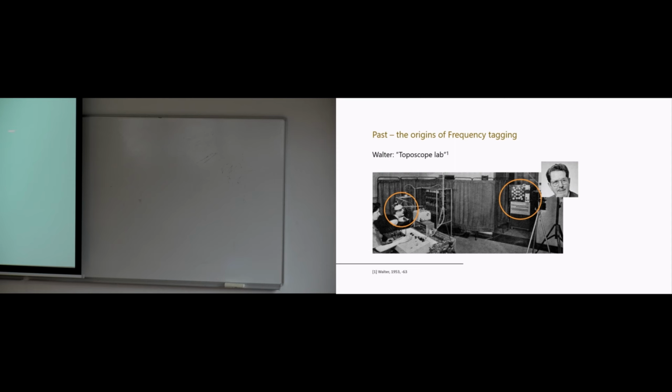And the most interesting part actually is this device back here. So they built this apparatus that allowed them to take the signal that they recorded, also from quite a high number of electrodes for the times back then, and look into the phase, the relative phase of the rhythms that they recorded from the scalp here, right? So I'm assuming that you're all relatively knowledgeable when it comes to oscillations. Oscillations come at a certain phase, and if you drive an oscillation and record it at different points of the scalp, you will record this oscillation with phase shifts relative to each other. And they were looking into that and trying to devise from these phase shifts how these waves actually travel across the scalp, or within the brain, inferring that from what's happening on the scalp. And they did that online, and that back in the 50s and 60s.